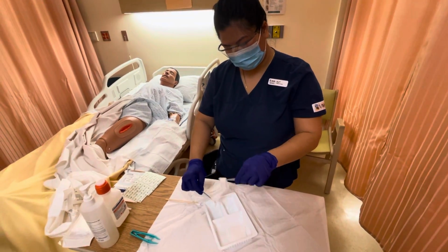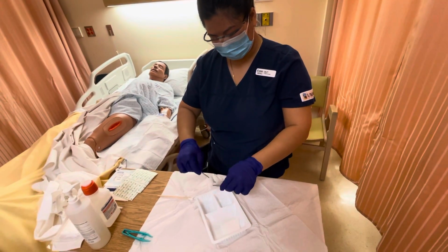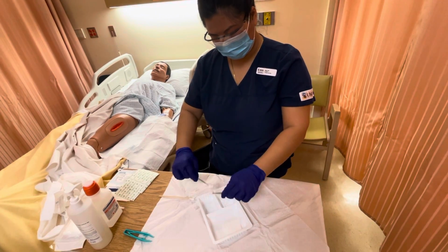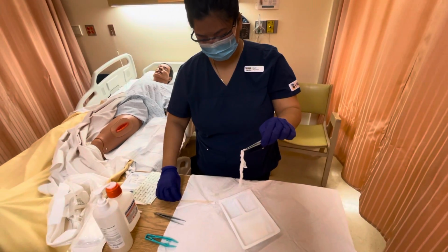I'm just going to wring that out one more time. Okay, so now we're going to pack the wound with a Q-tip.